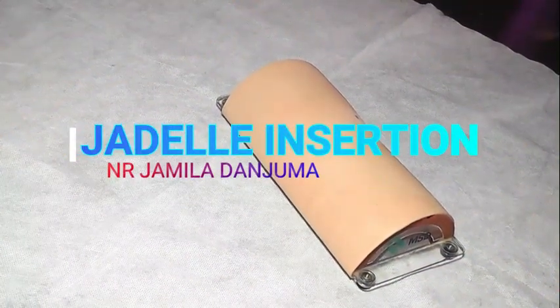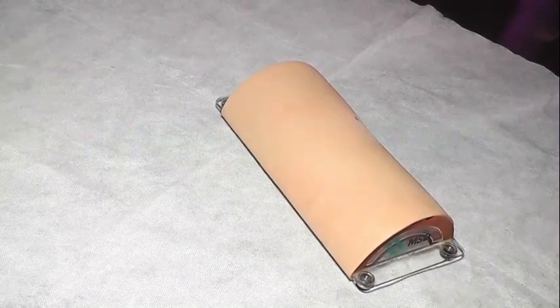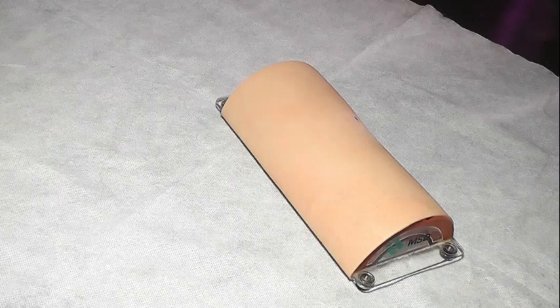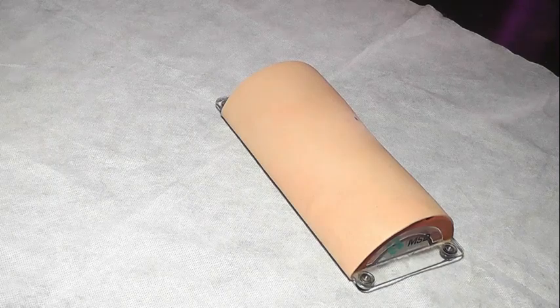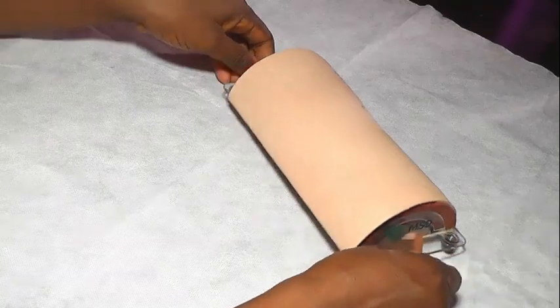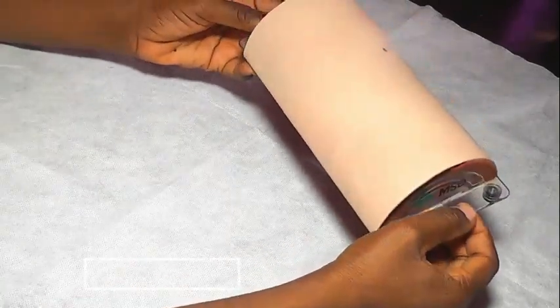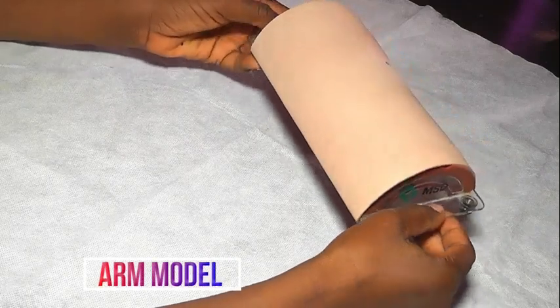Today we are going to be looking at insertion of Jadelle. Now in the insertion of Jadelle, I have a list of some of the requirements I need. Now this is my arm model. So I'll be using this arm model for the insertion.